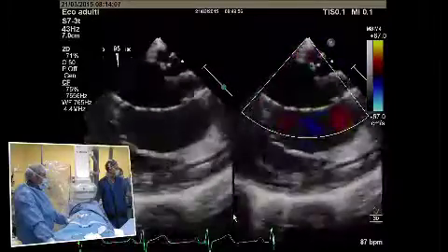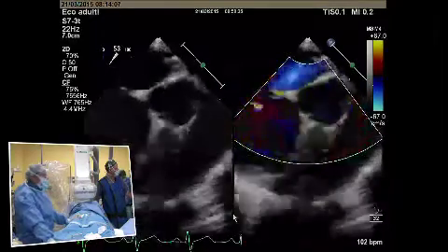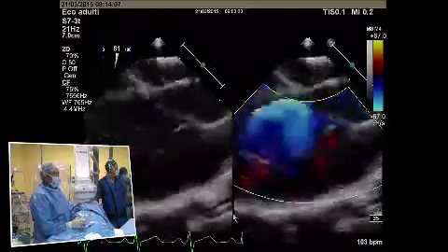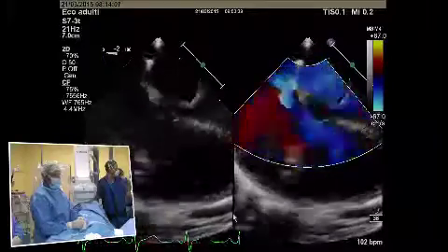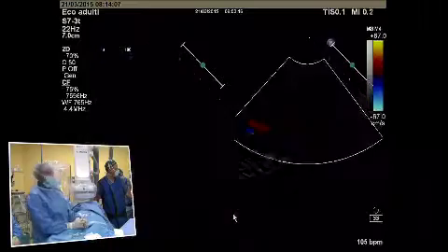So we have a question here, Allison. Good morning, Mario and Aki. It's Allison. I just wondered, with the really nice echo views and the fairly well-defined rims, would you consider just choosing a device size and perhaps not balloon sizing in this patient? Yeah, that's a very expected question.